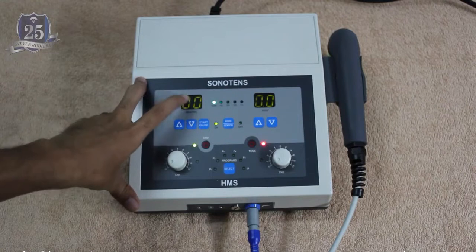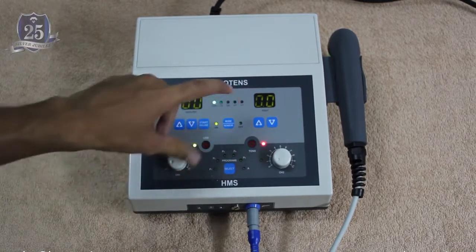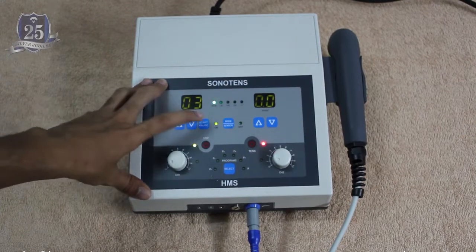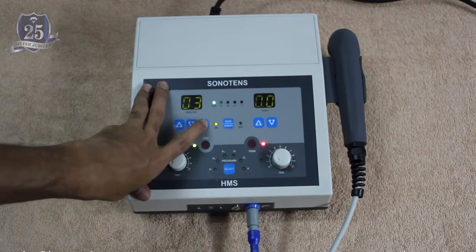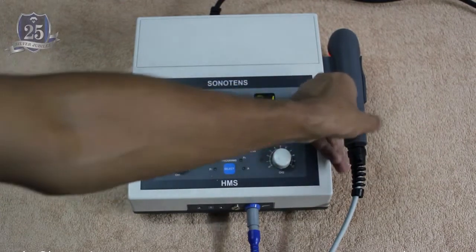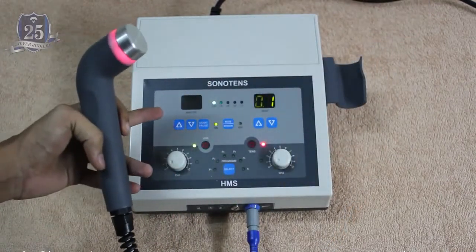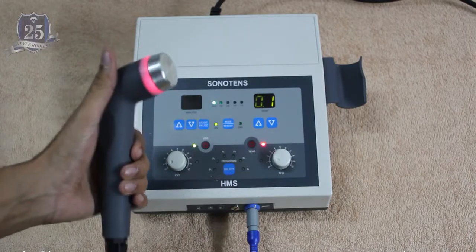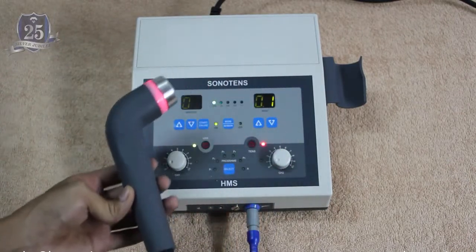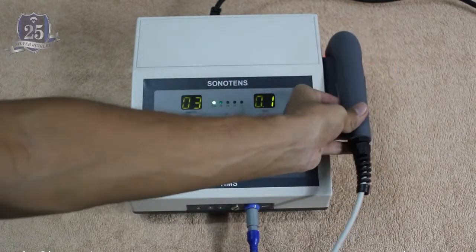Now we'll start with the operation of ultrasound first. Now the transducer is in auto sensing mode. We are setting the timer whatever you want, and I'm starting up the machine. So now the machine won't start because the transducer is not in contact with the skin. So the machine starts beeping only after getting in contact with the skin. The machine will start. So this is the auto sensing feature, which you'll be familiar with if you're using an HMS product already.